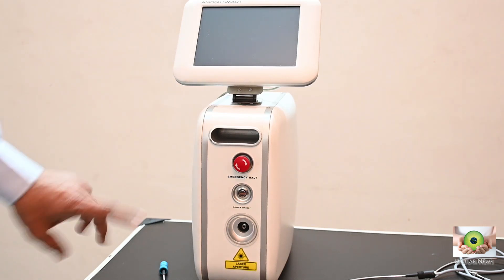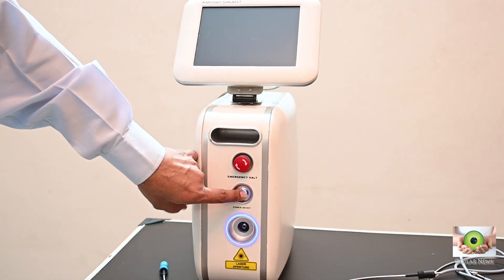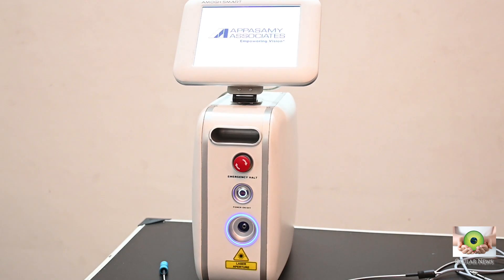Hi folks, today we shall evaluate the Appasami Amog Plus 532 nanometer green laser, which is a popular laser in use in everyday ophthalmic practice. Unlike most reviews however, we shall review not only new equipment but equipment which has been used for some years, so that buyers can get a better idea of total ownership experience in terms of product, service and support. So over to the four year old Appasami Amog Plus laser.